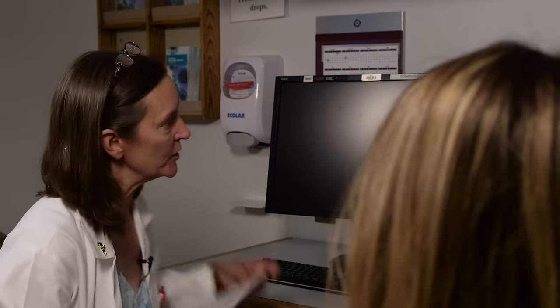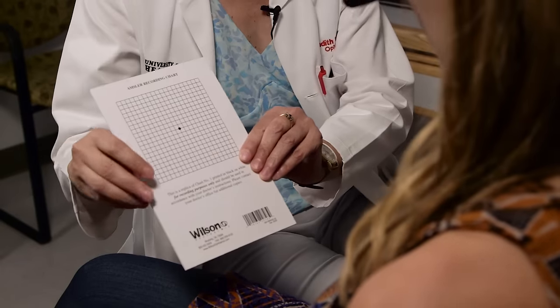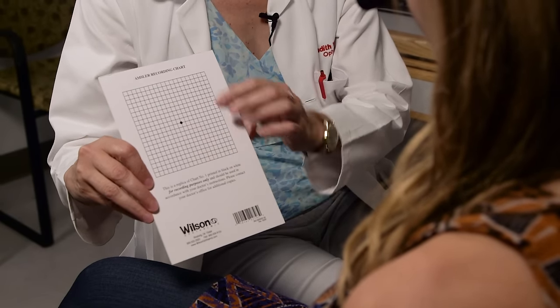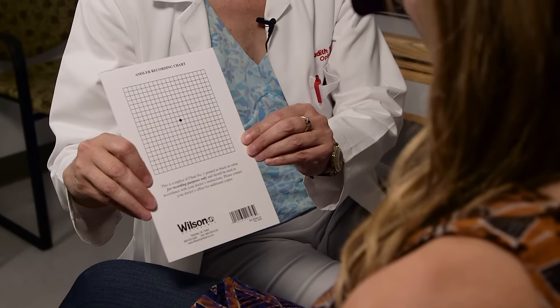When checking people's central vision, one of the other things we want to do is check an Amsler grid. We look at it in each eye individually. Hold that up and look at the dot in the middle. While looking at that dot in the center, see if you can see the whole grid. Is there anything missing, wavy, or distorted? No.